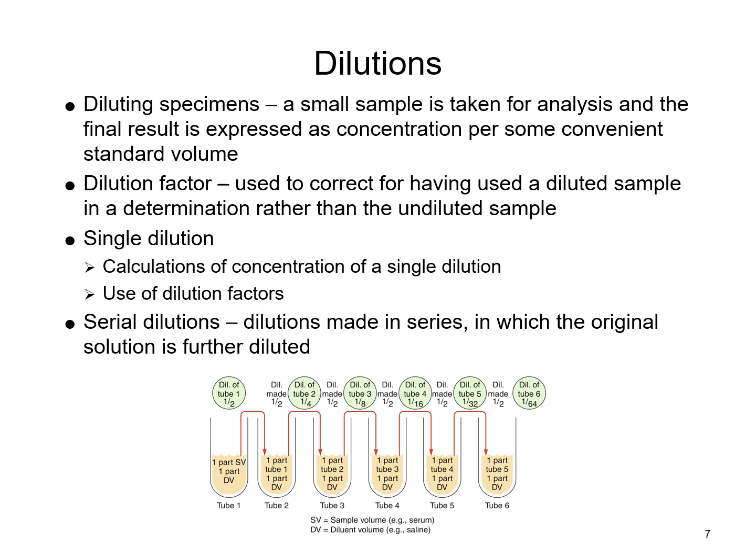If you do a dilution, then you will need to know that dilution factor. Again, this is why we concentrated on determining these within lab math, because once you figure out your dilution factor, you're going to multiply your final result by that dilution factor to get your final concentration.